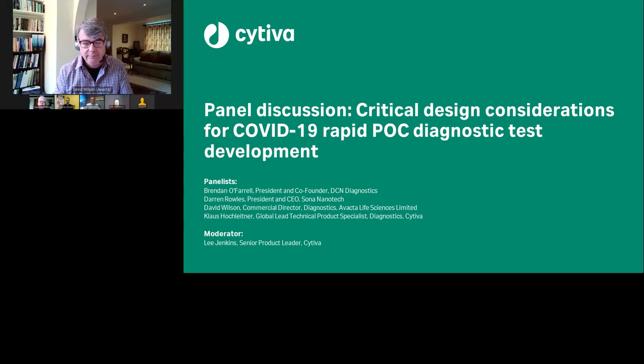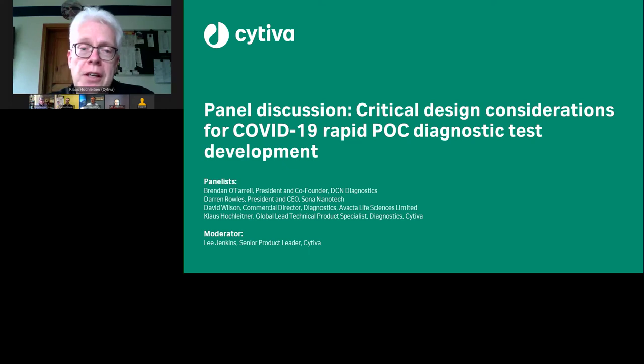yeah, definitely yes. So in an infectious disease test, regardless what we are talking about, it doesn't necessarily have to be SARS-CoV-2 and COVID-19, what you're looking for is the best possible sensitivity, because you do not want to see any false negatives. You will never get 100% sensitivity, since there will always be clinical outliers that you simply will never find, regardless how good you do your clinical validation.